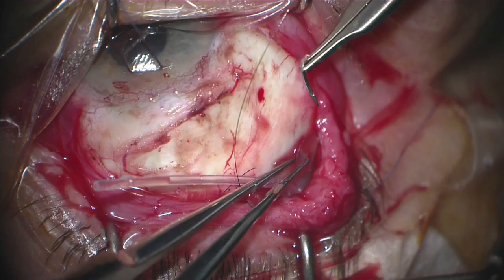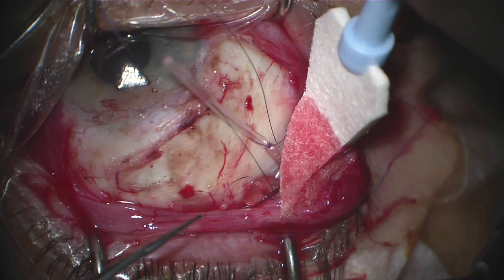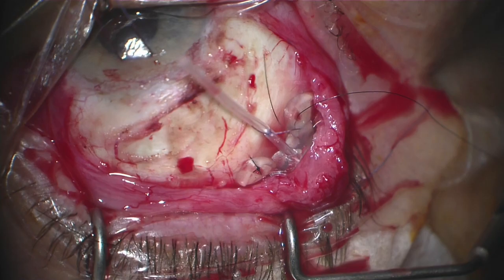The implant needs to be secured approximately 8 to 10 millimeters posterior to the limbus. I think the further back you get the implant placed, the better flow you get, and there is a lower likelihood that you're going to end up with a case of post-operative strabismus.